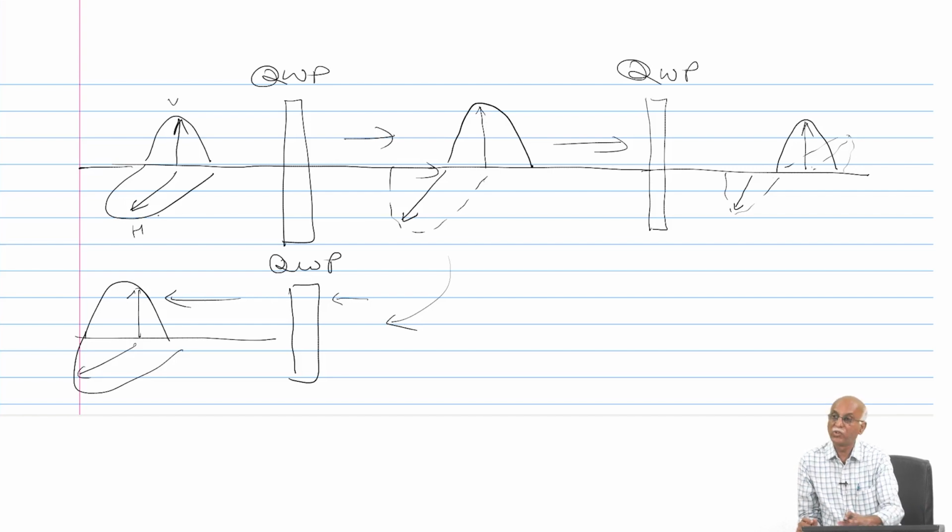However, this you remember, quarter wave plate. Two quarter wave plates combined is known as a half wave plate, because it rotates by 180 degrees, or it moves faster by 180 degrees. Is it okay? Are you understanding? So, these materials are all birefringent materials. They have refractive index depending upon their axis, optical axis, all this.